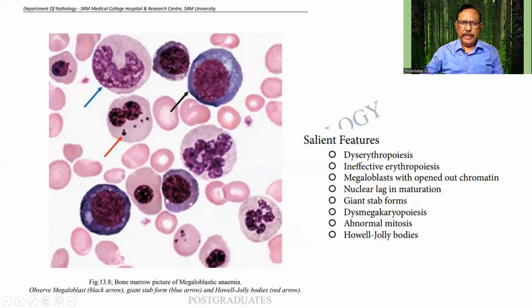I would like you people to kindly appreciate it is from my text, one page. This is a bone marrow picture in a case of megaloblastic anemia, wherein I am seeing certain changes. This large cell with a bluish cytoplasm is probably a promegaloblast, equivalent to a pronormoblast. Then you get the basophilic normoblast or megaloblast and so on. But in this case, I am finding a large nucleus, slightly eccentric, one or two nucleoli, and there is a basophilic cytoplasm. Same is being appreciated over here.